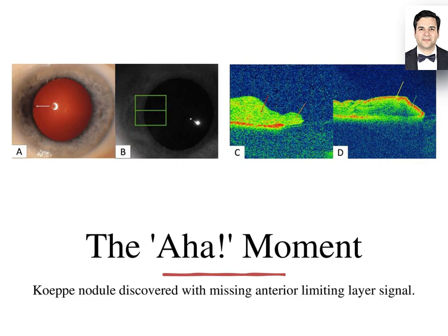This observation sparked a fundamental question in my mind. What are the iris layers involved in this change? Suddenly, I realized, despite my training and clinical experience, I wasn't sure how to identify each iris layer on AS-OCT, nor could I easily recall their detailed anatomy. It was a gap in my knowledge, a missing piece in my ophthalmic bank.